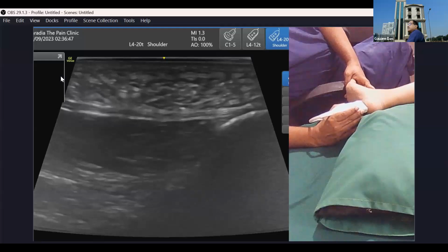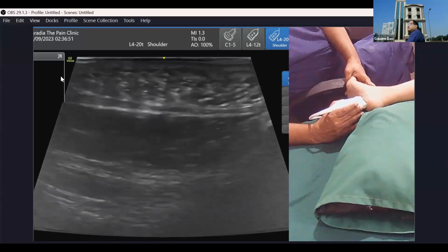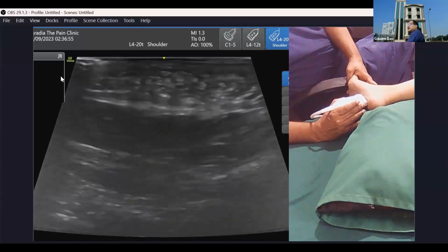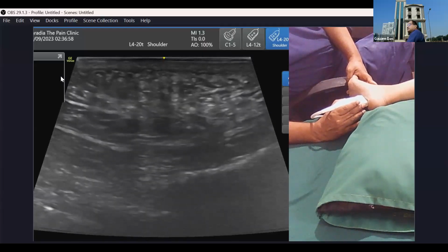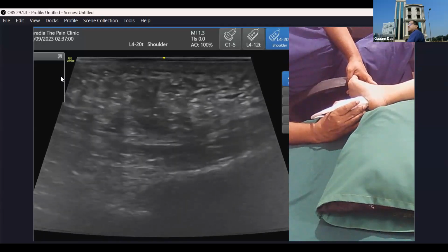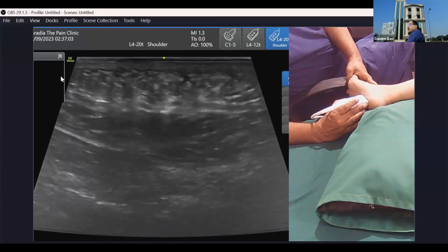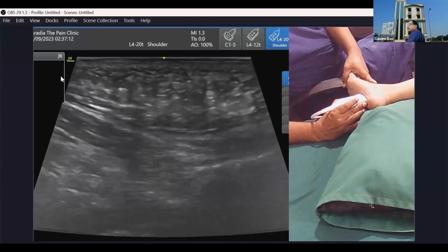If I go more distally, see what is happening? It is coming more superficial. The fat layer is most thick towards the heel side, and you can see the 2 muscle layers. The middle one is the superficial one. Below the plantar fascia is your flexor digitorum brevis. Below that, quadratus plantae.